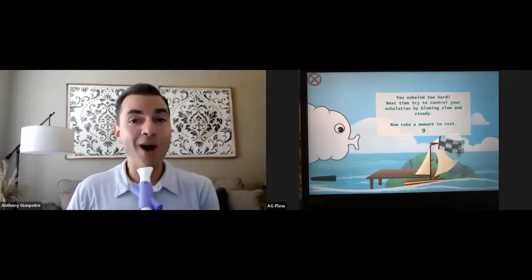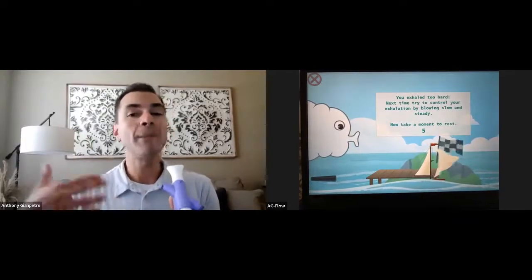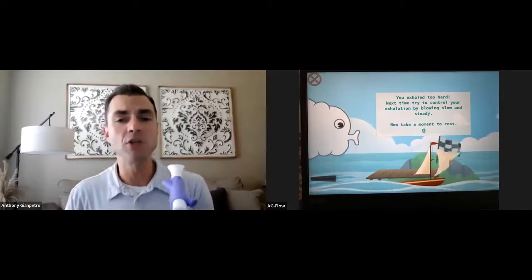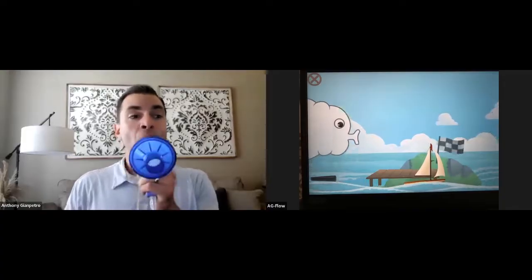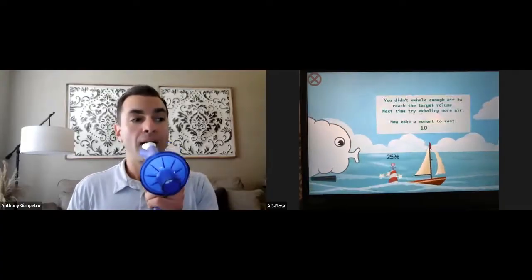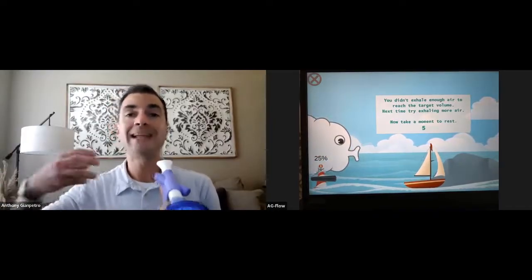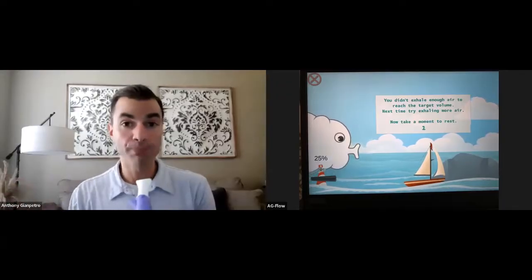And see, I went too hard again, so you would have to educate me. Anthony, you went too hard. Give me about maybe half of what you did there for this next one. And then let me show you what happens if you do the second violation for this activity. You'll notice that I didn't exhale long enough. It wasn't too forceful, but I didn't accommodate that volume that I asked the activity to do, okay?